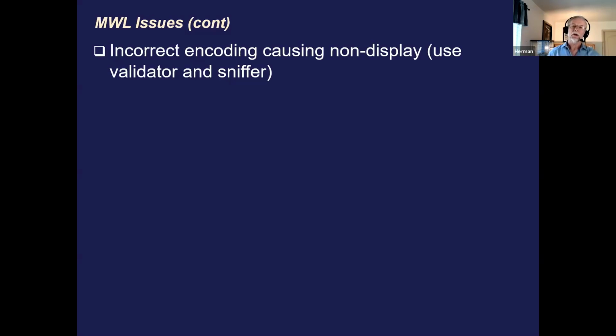What happened is that one of the attributes in the worklist happened to have the wrong value. In the DICOM standard, there are a couple of required attributes that have certain codes required according to the tables defined in the DICOM standard. In this case, it did not meet the requirement, so it was empty. It took that vendor probably a week to figure out what was going on.